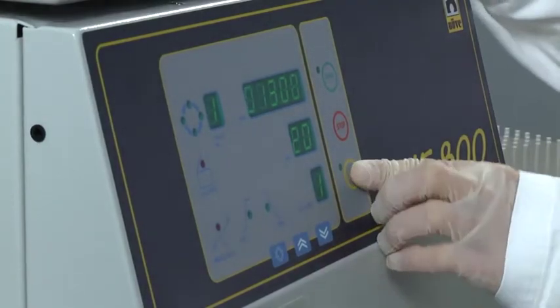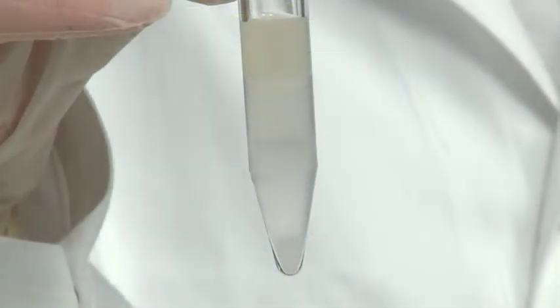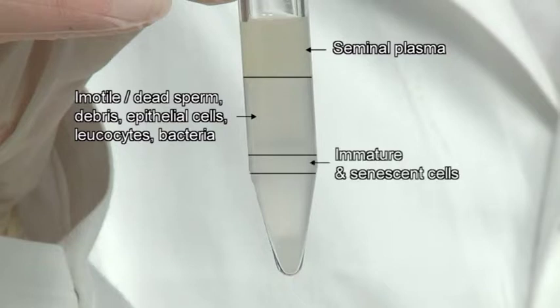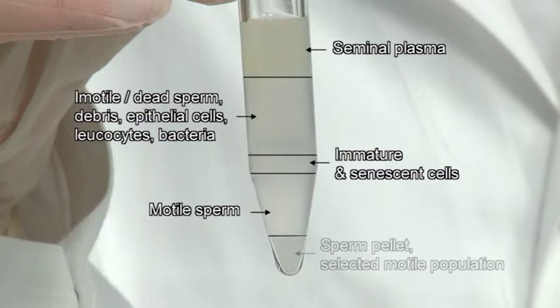After centrifugation, the ejaculate is separated into seminal plasma, immotile dead sperm, debris, epithelial cells, leukocytes, bacteria, immature and senescent cells, motile sperm, sperm pellet, and selected motile population.